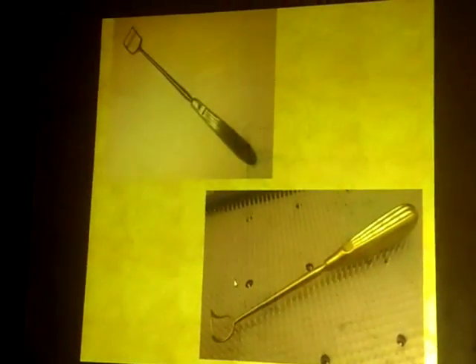The most common two types that we use these days are the Beckman adenoid curette and the Brunhill adenoid curette. And I want to address your attention to this small knob or small depression at the handle of the adenoid curette, and I will tell you what's the function of this or how can we use it.